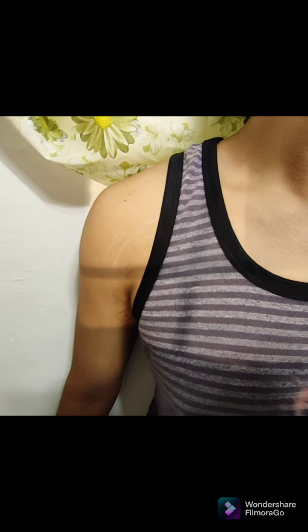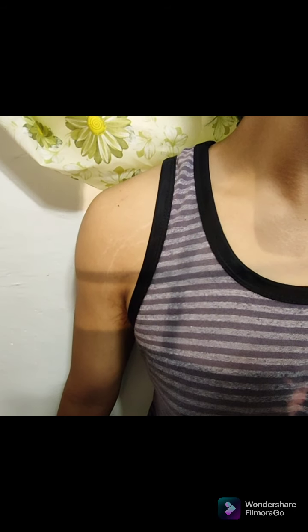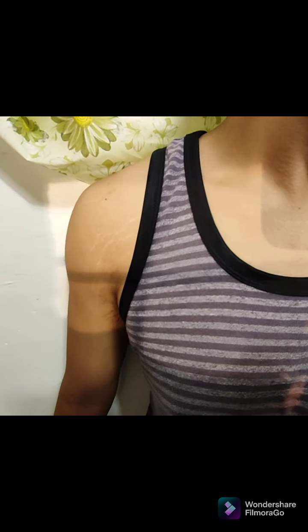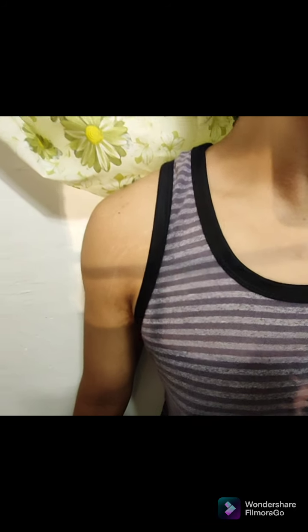So, balik tayo. Dito ang coracoid process, slightly lateral. I guess mga an inch or a half inch. Then, slightly inferior. So, dito banda, mid-scapulohumeral joint. So, before natin i-shoot ang beam, as always, is to suspend the patient's respiration during exposure.